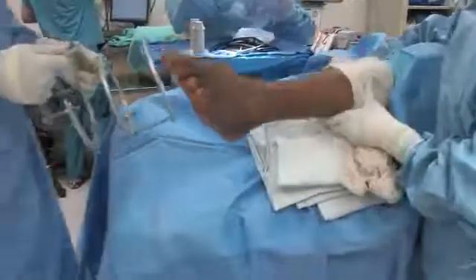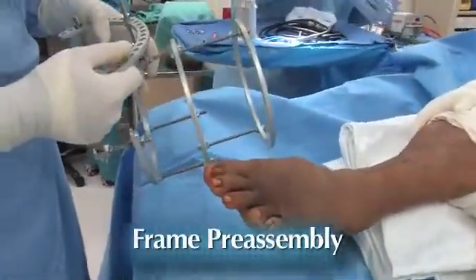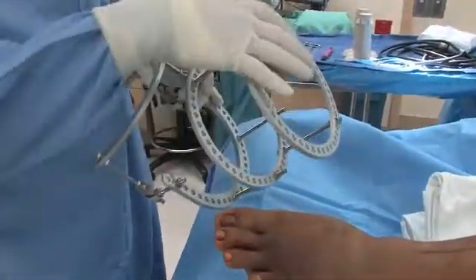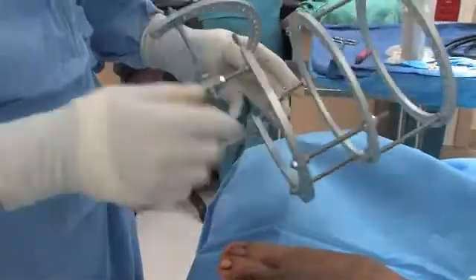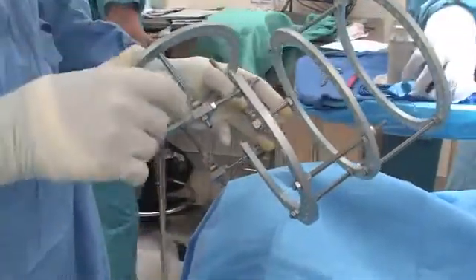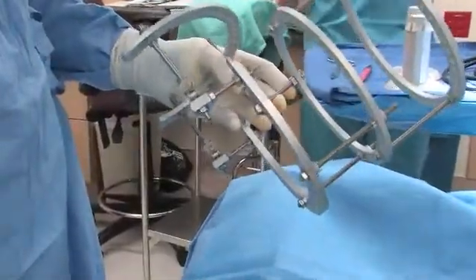So this ring was pre-built. We've determined that it was a 160 millimeter ring for the size of his leg. The idea is to give room between the leg to expand for edema inside the ring once the ring is on. This one is pre-built with hinges, universal hinges, and extension and distraction and compression rods, and this is determined to help move the forefoot around.